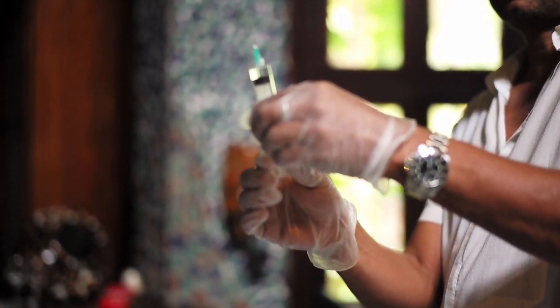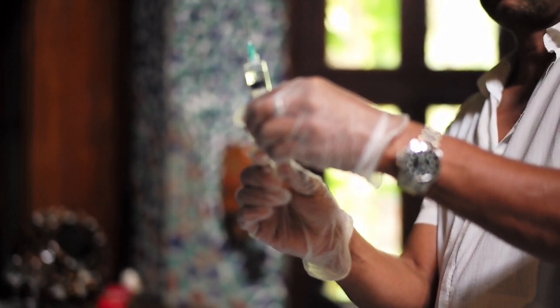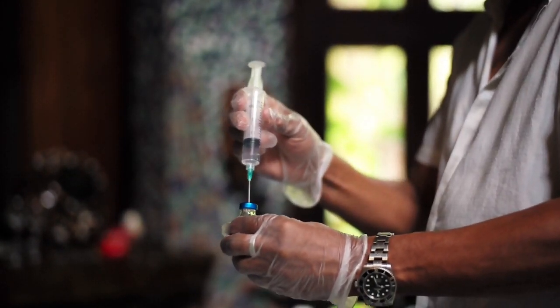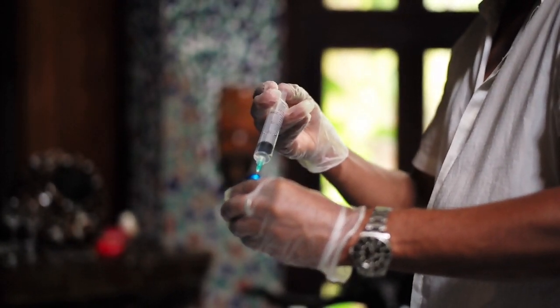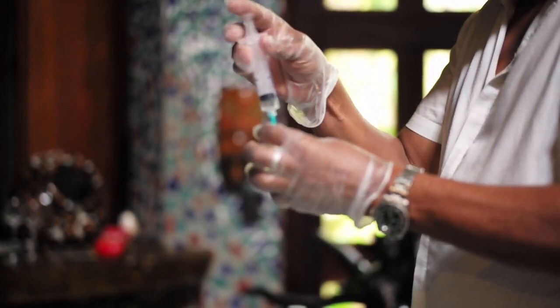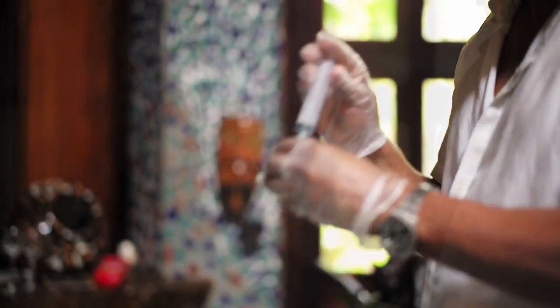really, you don't need to get the air out right now. Pull this back some more, get some more air in it. And now we're going to put it into the antibiotic vial. Push the plunger in. Get all the saline in. And shake it up. You're going to want to shake it for maybe 30 seconds or so.